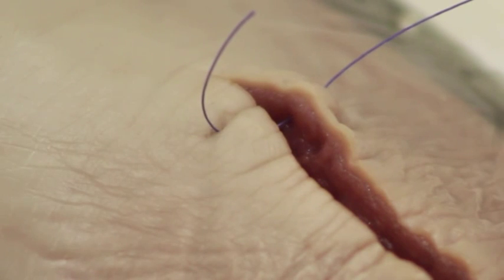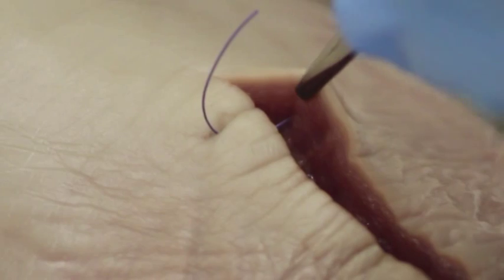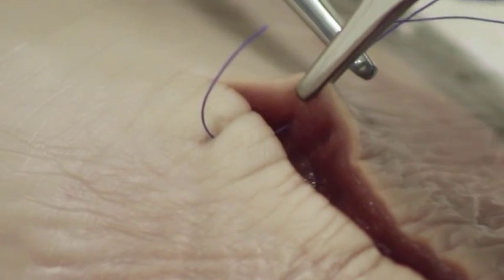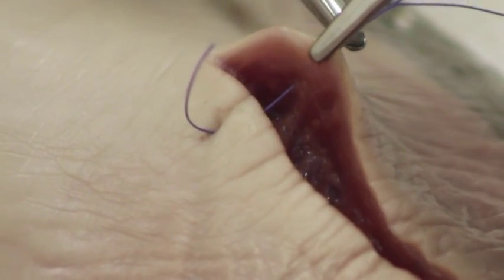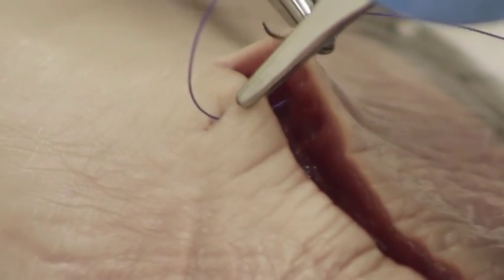Turn your needle around and what you need to do is just grab the edge of the skin very superficial. Same thing on the other side.